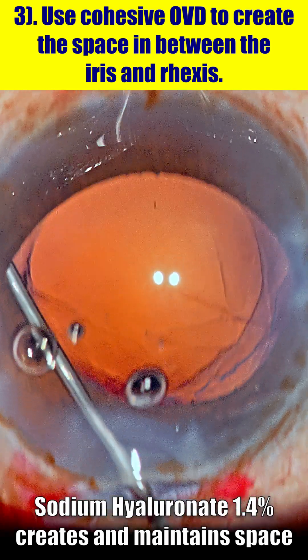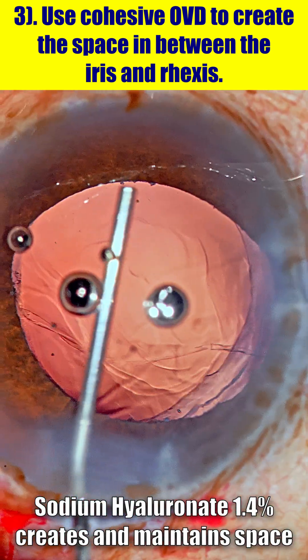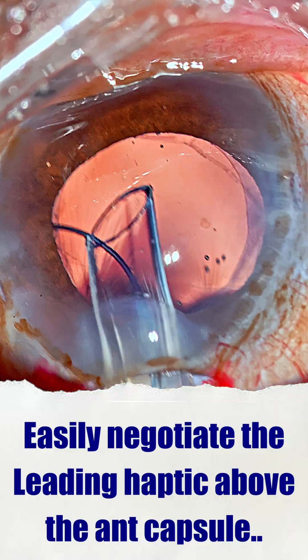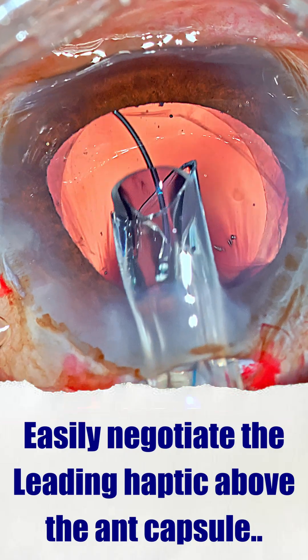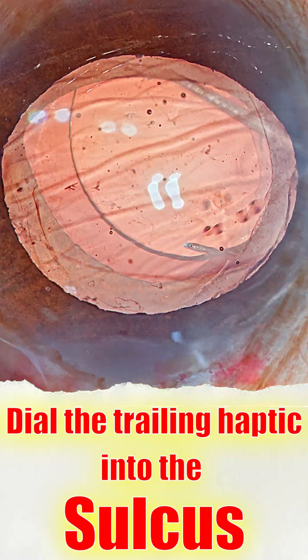Tip number three: use a cohesive OVD — that's sodium hyaluronate. We want an OVD which can create and maintain space so we can easily negotiate the leading haptic into the space above the anterior capsule, and then also dial the trailing haptic into the sulcus.